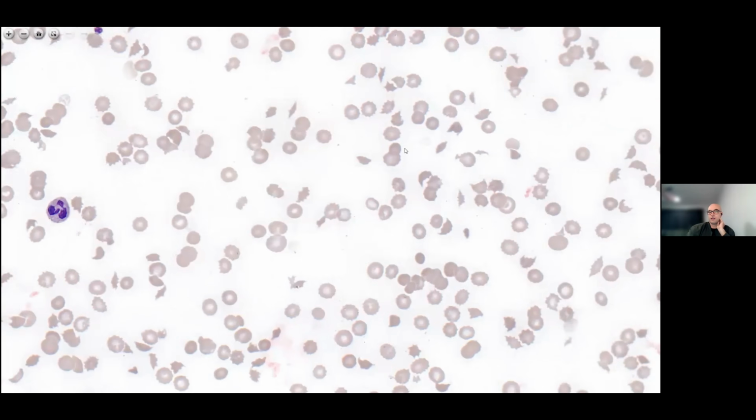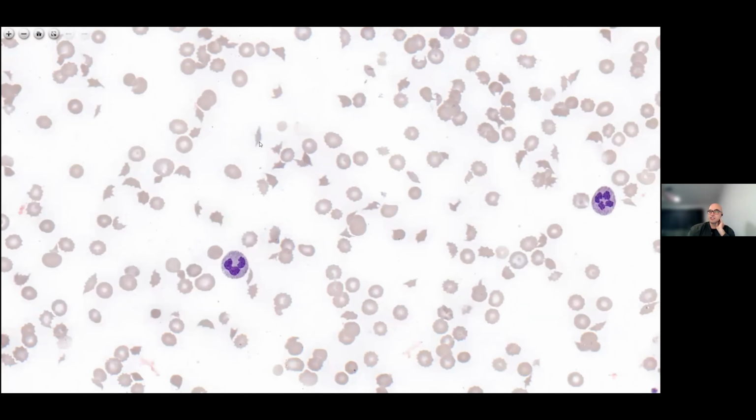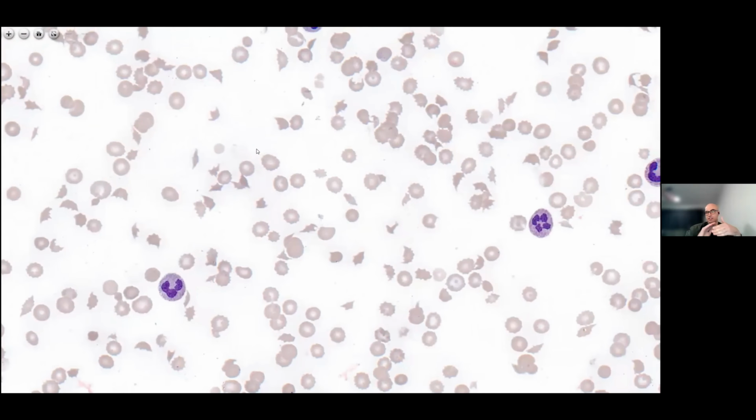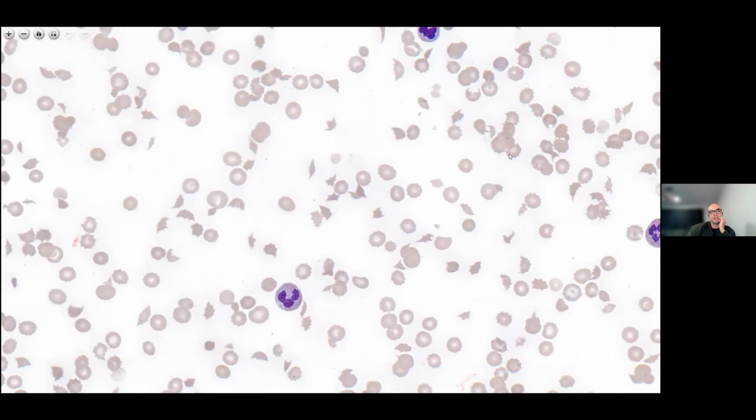And then the high shearing force, the high flow across it from the heart pumping, will start tearing the cells. And the cells get a tear in them, and because they have a bilipid membrane, they'd love to reform after they've been damaged, but they've lost their structural integrity and they form this elongated cell with two pointed ends.